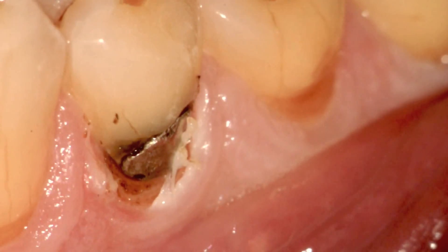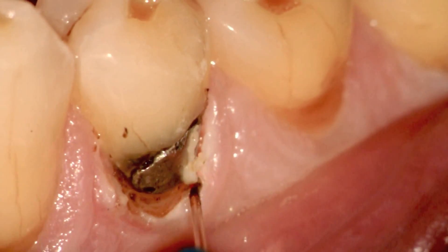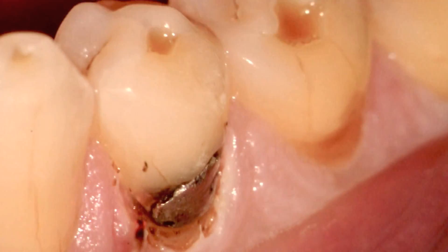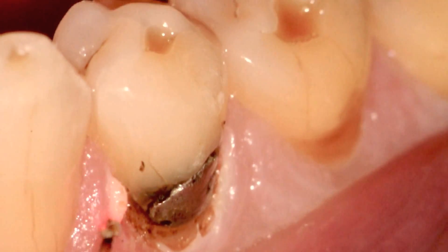Now many times I get asked: what happens if accidentally, when you're working away, your diode laser touches the metal? Will you get arcing or sparking like you would with Electrosurge? Well, just to show you here, you'll find that with these short brush-like strokes, you don't see any interaction with the metal.